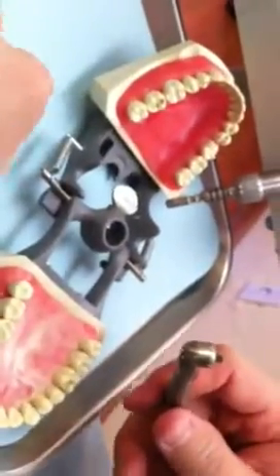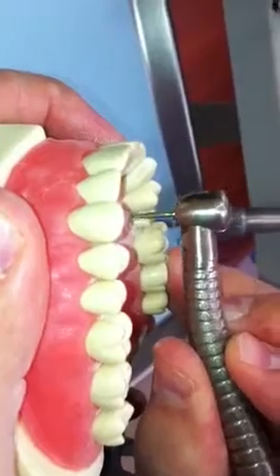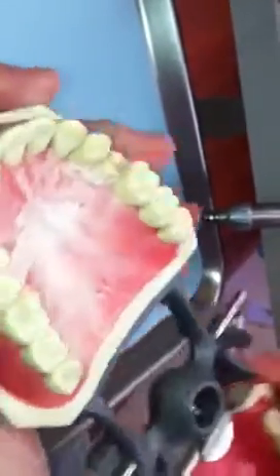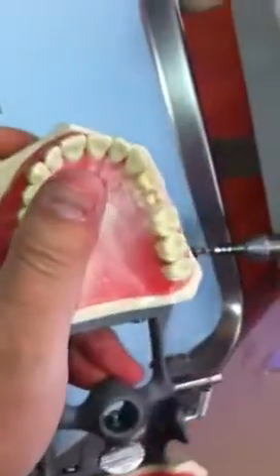I lovingly refer to that one as the Costello prep. I'll refinish the margin — I'm all for that — but in general terms, you cannot turn the patient around like this. That's a feather edge prep. Can't do a zirconia crown on that. You have some room and can do most crowns on that, but a feather edge margin has no support and is not very aesthetic.